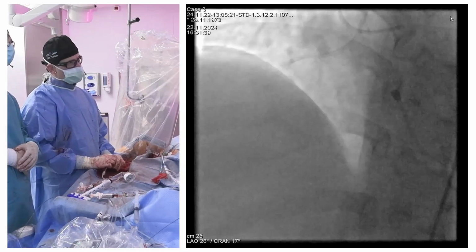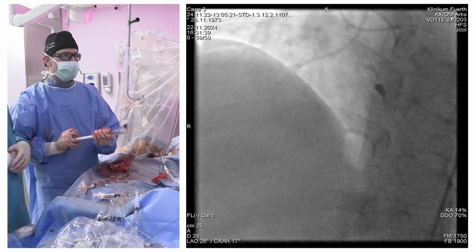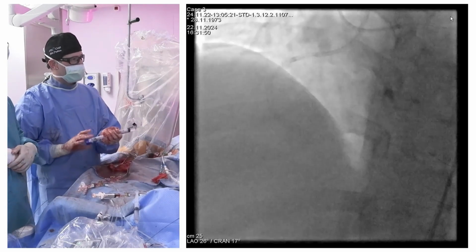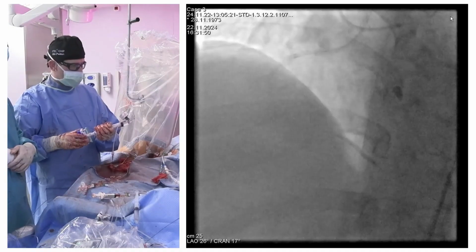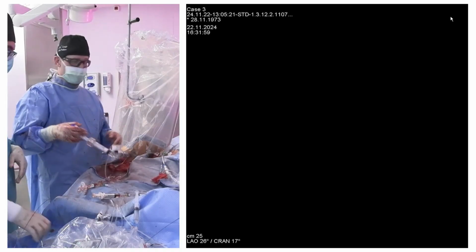This is still something. We still have almost the same drugs on the balloons in 20 years. So we might have to consider finding something else, something cool, some RNA or something.